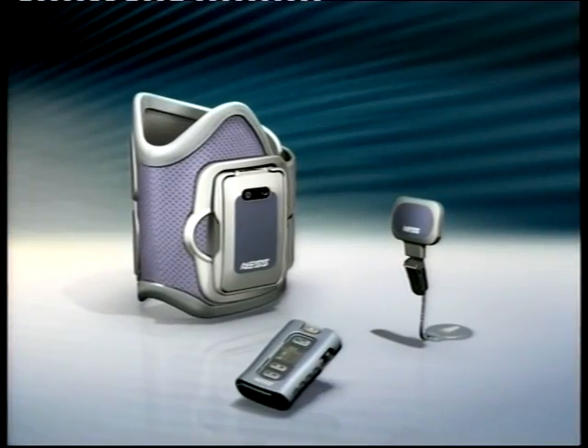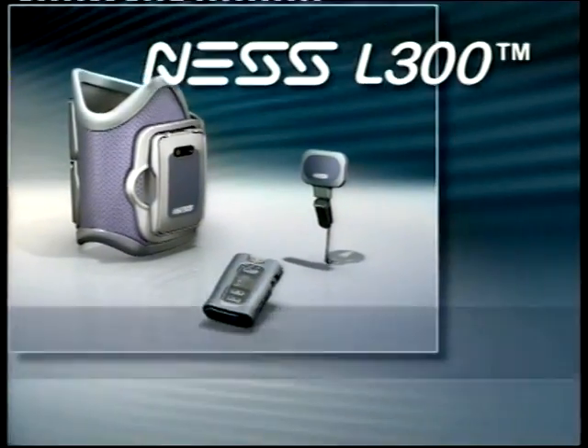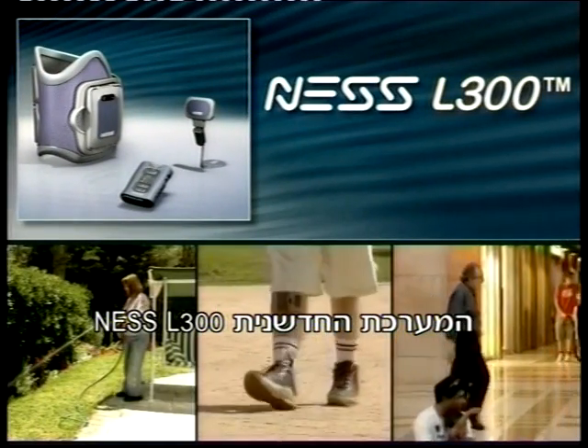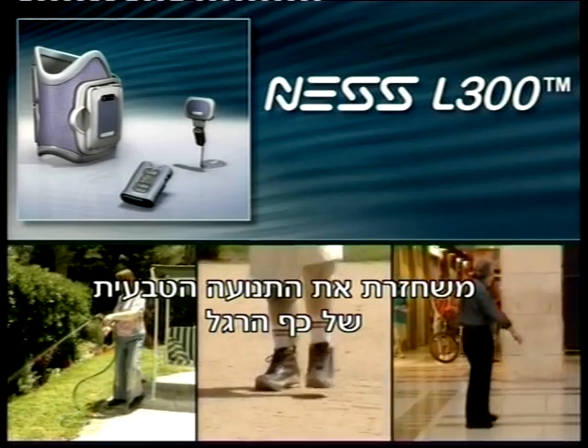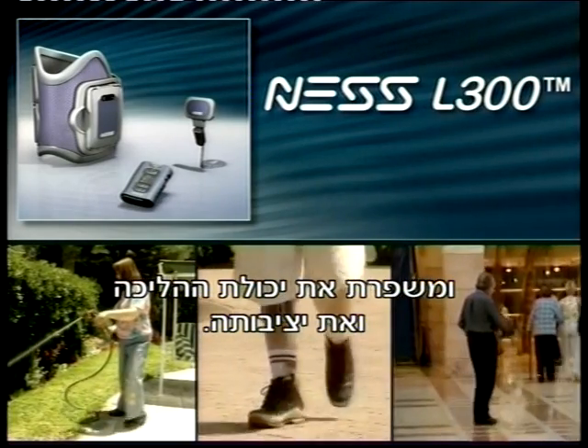Now, the treatment of foot drop is stepping into a new era. The innovative Ness L300 Neuroprosthesis, which restores natural ankle movement and increases overall stability during ambulation.